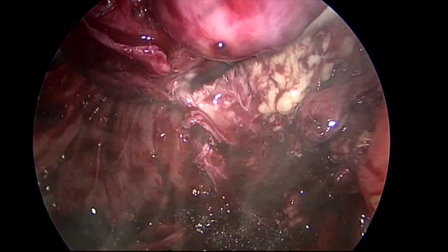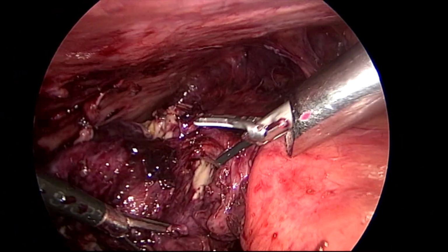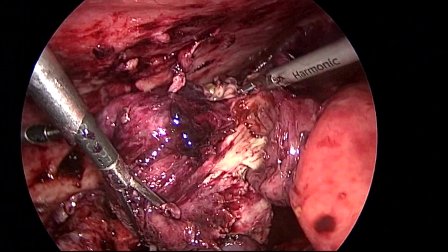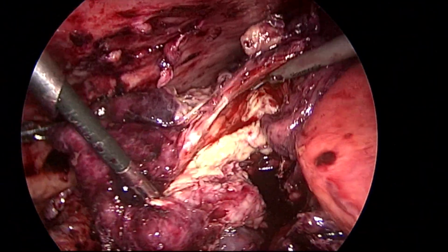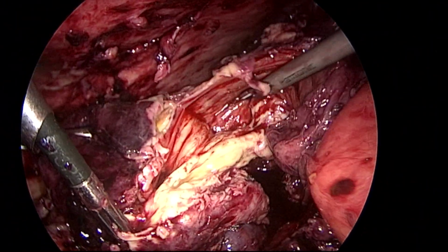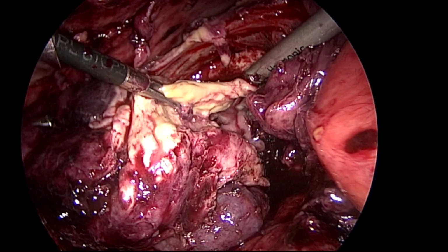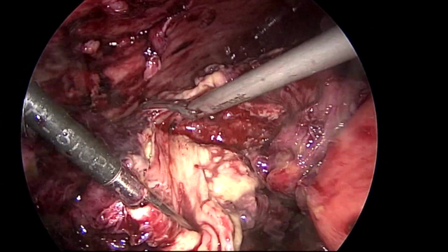You can see even between the mucosa and serosa there is a lot of collection of pus. Now you can see the mucosa, it is white in color. It is almost gangrenous, and pus is there between the mucosa and the serosa. Now you can see the pus is coming down. So it is an empyema gallbladder.